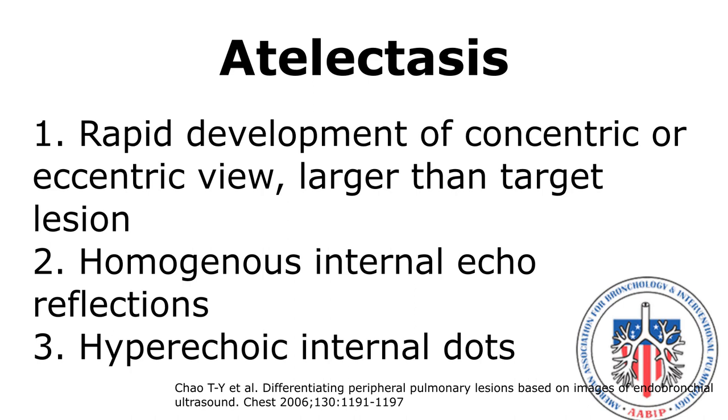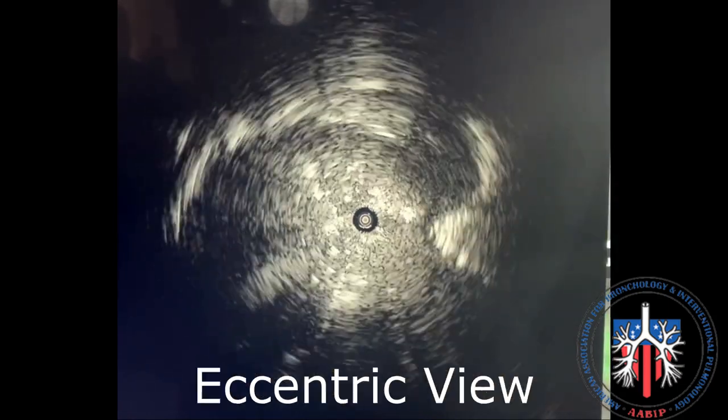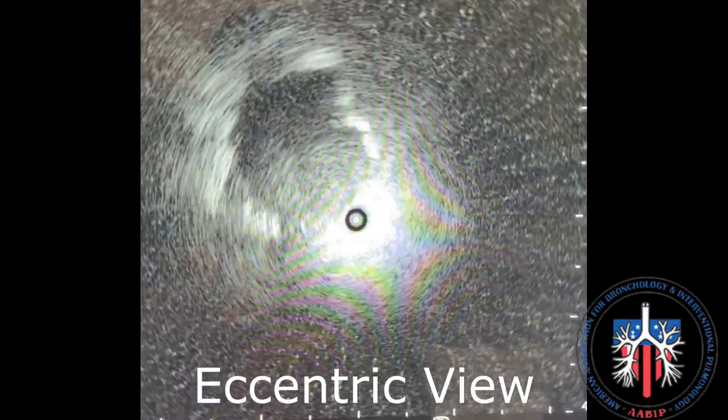There are no definitive ultrasound features that confirm atelectasis, but the following ultrasound findings may suggest that atelectasis is present: rapid development of a concentric or eccentric image larger than the target lesion; homogeneous internal echo reflections of vessels and bronchioles without a distinct margin; and hyperechoic internal dots. This is an example of atelectasis. In an eccentric view, the target lesion is tangential to the center of the probe. The lesion is heterogeneous and darker than the surrounding lung, demarcated by hyperechoic lung that is adjacent to the lesion.